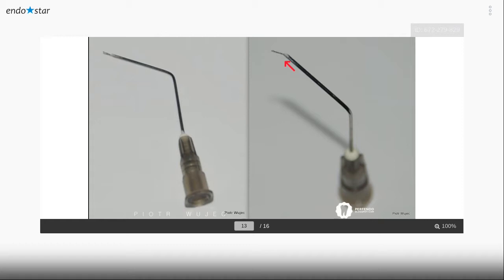The phosphoric cement is completely white, so we can see under the microscope where the excess cement is, and we can remove it with ultrasonics, try again to loosen the broken instrument more, and make a second attempt with the modified injection needle.